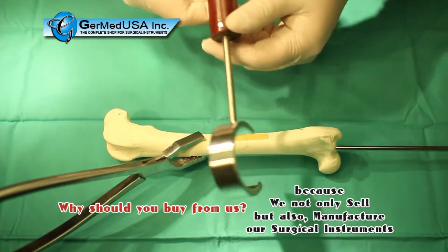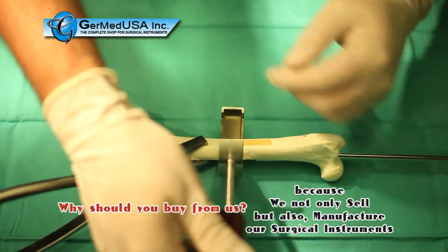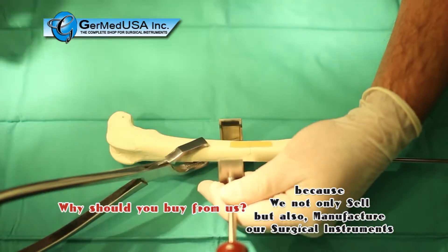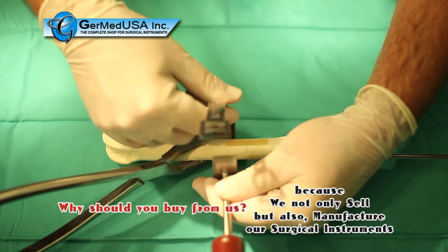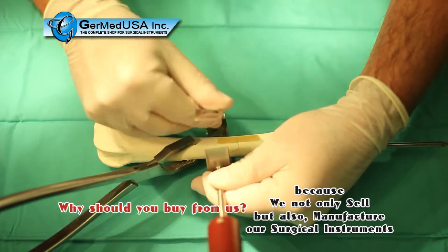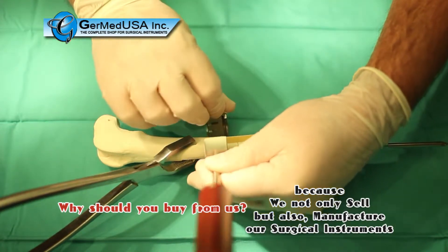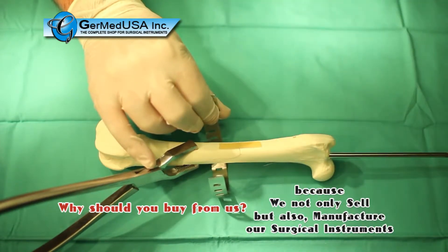After retracting the soft tissues, the passing guide is placed around the bone, open in toward the surgeon, and the band is fed into the channel and around the bone. Pre-bending the band will facilitate ease in passing. Once the band is in place, simply retract the passing guide.